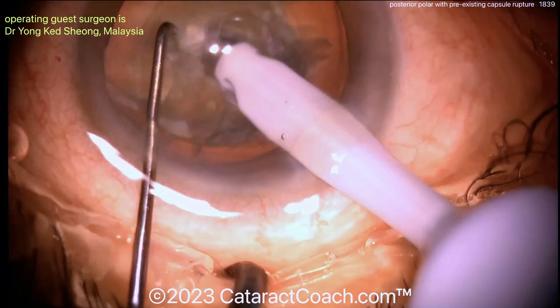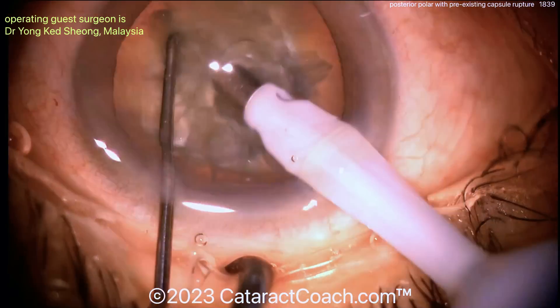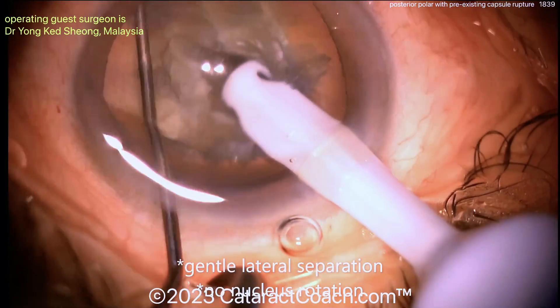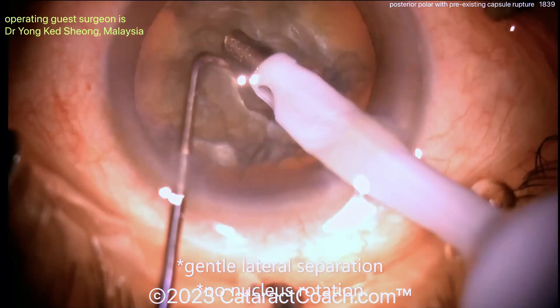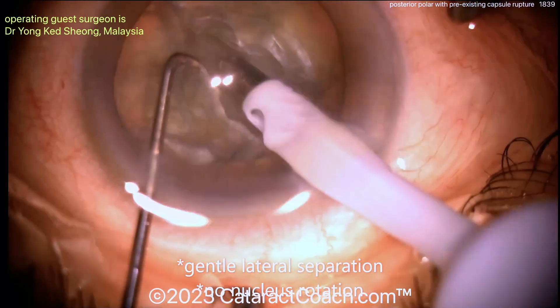Let's get a chop going — lateral separation. Do not push posteriorly, otherwise you'll rip the posterior capsule even bigger and it'll be more of an issue. So again, trying to get these pieces split.